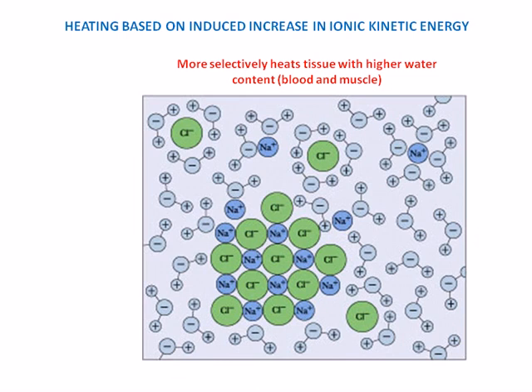Heating occurs as tissue ions are exposed to the electromagnetic field. Their movement is accelerated in one then another direction. Ions then collide with molecules, thereby increasing kinetic energy and subsequent generation of heat.